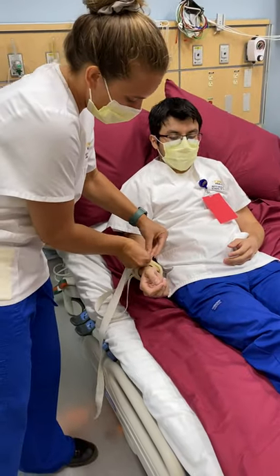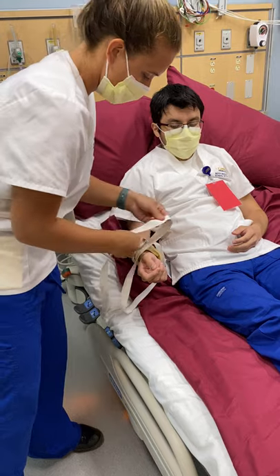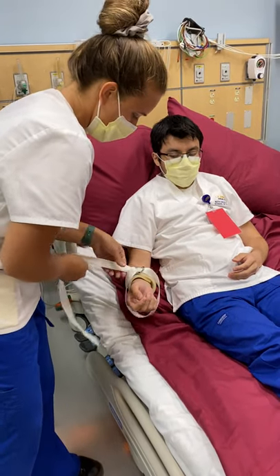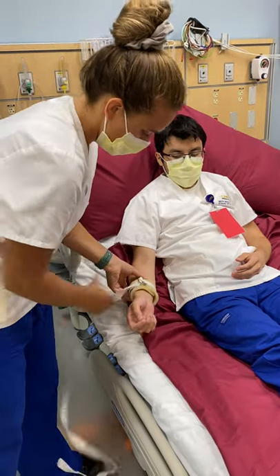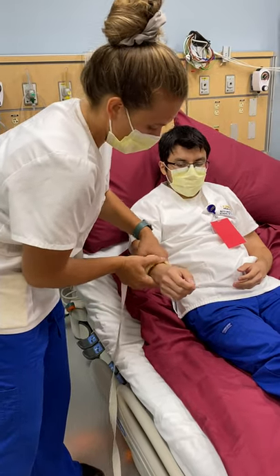So it's going to go through like that and then tighten. So it's like that — it's not going to be too tight.